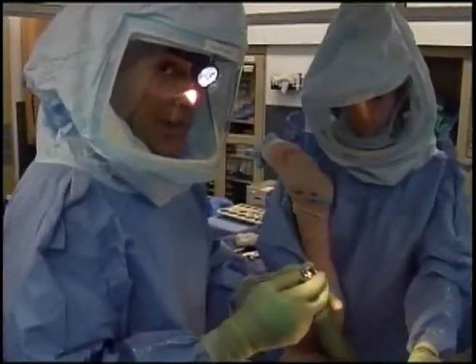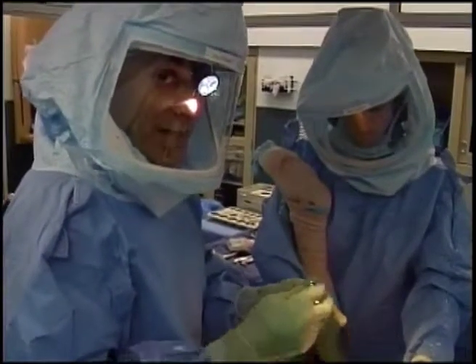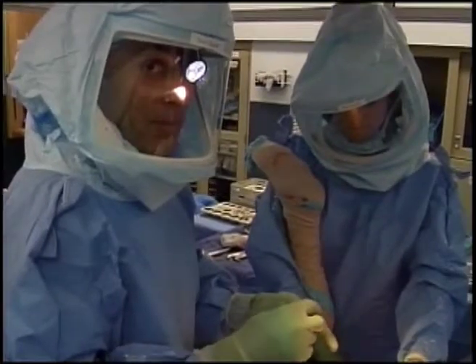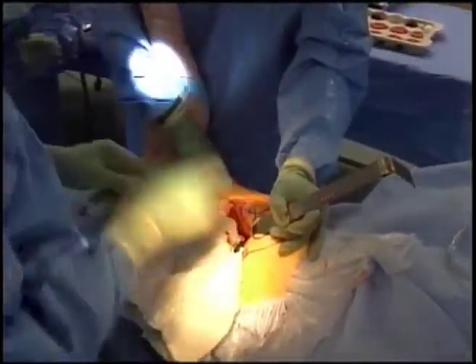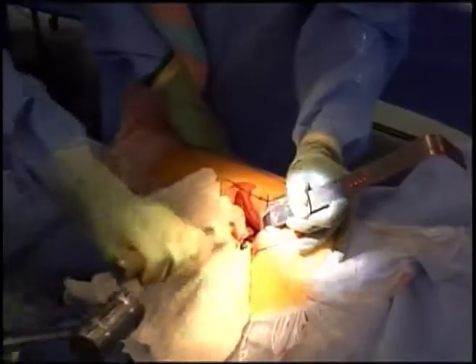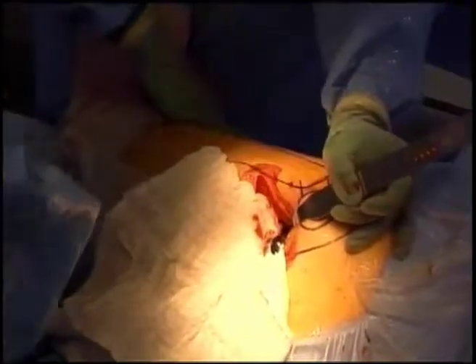This is the final hip ball, which we now place onto the stem — the thigh bone portion of the hip replacement — and then reduce the hip by popping it back into place. The hip ball is now locked onto the implant.